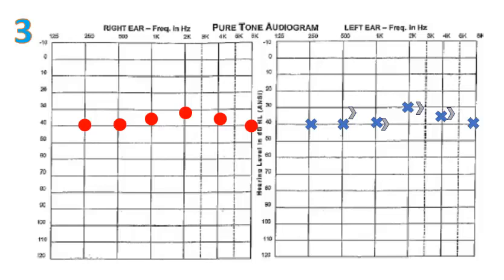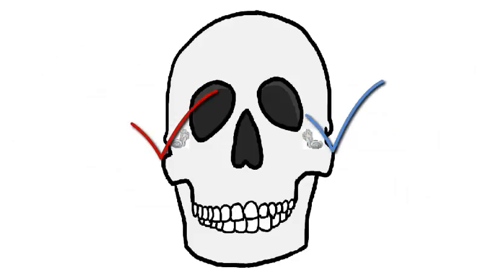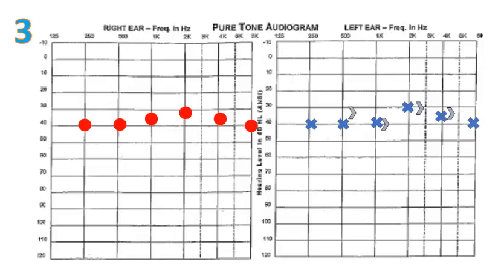If we apply each unmasked bone conduction threshold to each air conduction threshold on either side, there are no air bone gaps present. So we can conclude or infer a sensory neural hearing loss on each side, even if we don't know which ear heard each specific bone conduction threshold. We've ruled out air bone gaps at each frequency from both ears. In this instance, we don't care which ear has heard the unmasked bone conduction signal. We just know that there's no air bone gap indicated on either side.